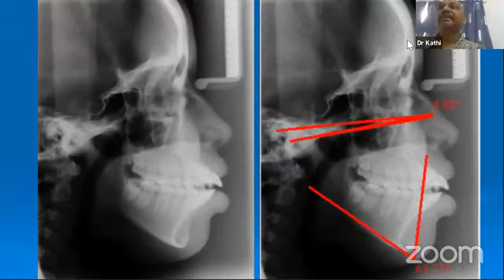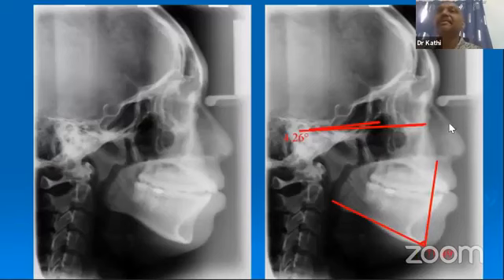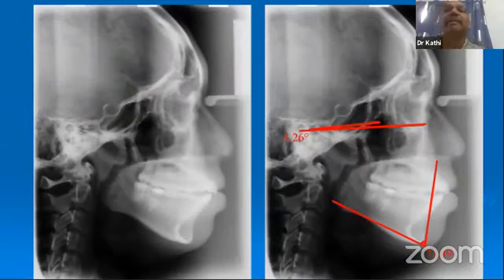Yeah, like this is an example. So this degree here is 61, 61 plus 4.82. This is a skeletal discrepancy. Whereas this one, 75, is more of a dental open bite. So the earlier one might not be able to camouflage. This one we might be able to camouflage.